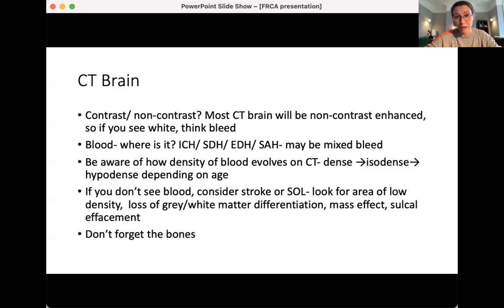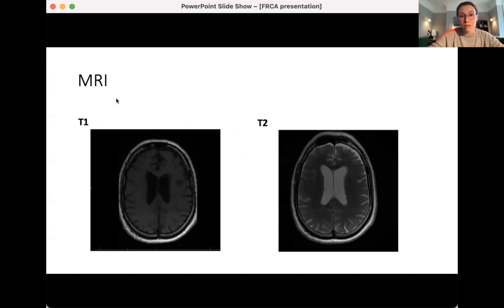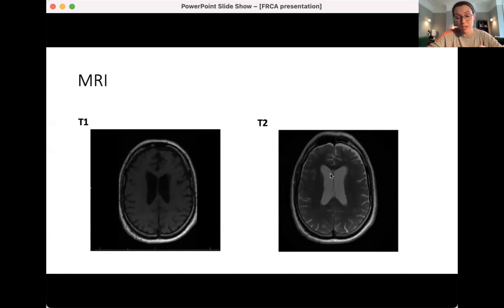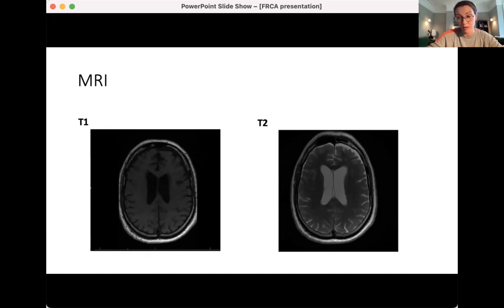If you don't see blood, think about what else you would identify on the film — think about stroke, space-occupying lesion — listen to the history, and don't forget the bones. For MRI, differentiating T1 and T2 weighted images: on T2 weighted images fluid is high signal, whereas on T1 weighted images fluid is low signal. Look at the CSF signal to determine whether it's T1 or T2.